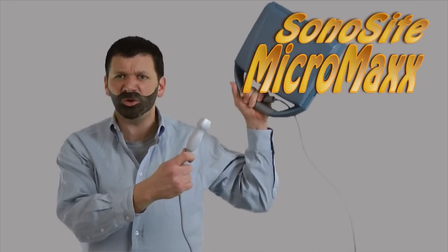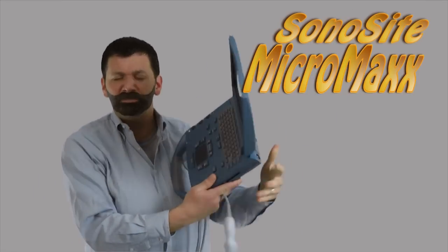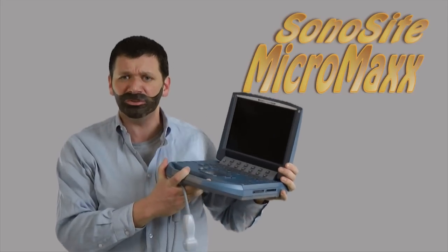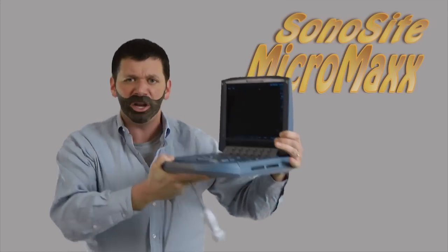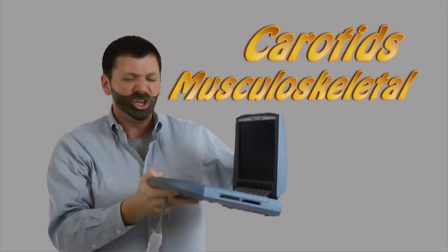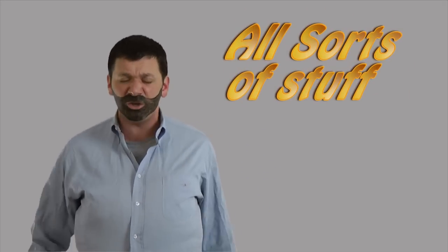Hi, Brian Kale here for the Sonosite Micromax Ultrasound System. It's small, it's durable, it boots up quick. And if you're tired of carrying around a 400-pound ultrasound machine and waiting for it to boot up, watch this. You push the button, in about 12 seconds it's up and running. You'll be scanning carotids, scanning musculoskeletal, scanning all sorts of stuff, doing needle injections, and scanning other parts too.